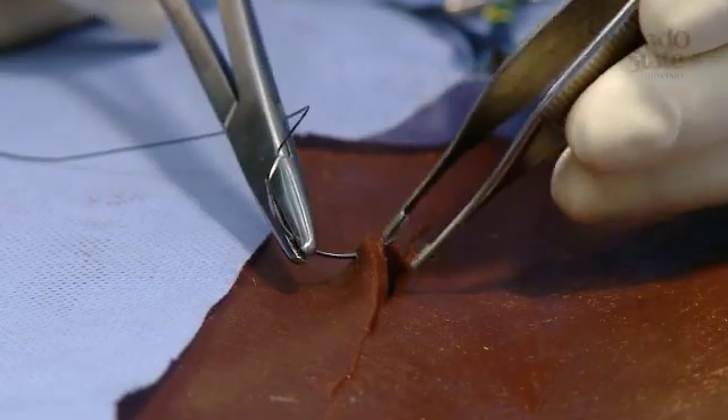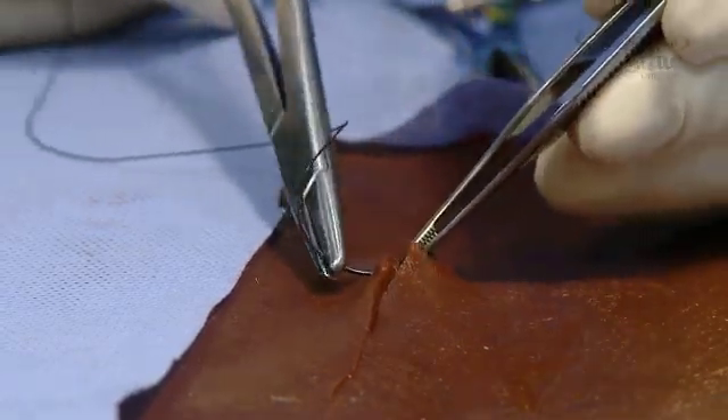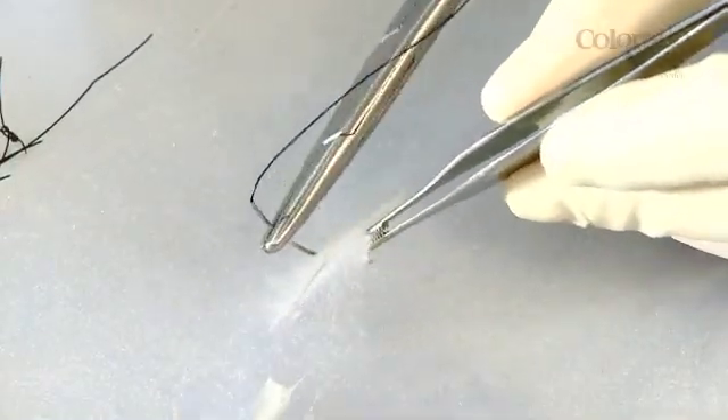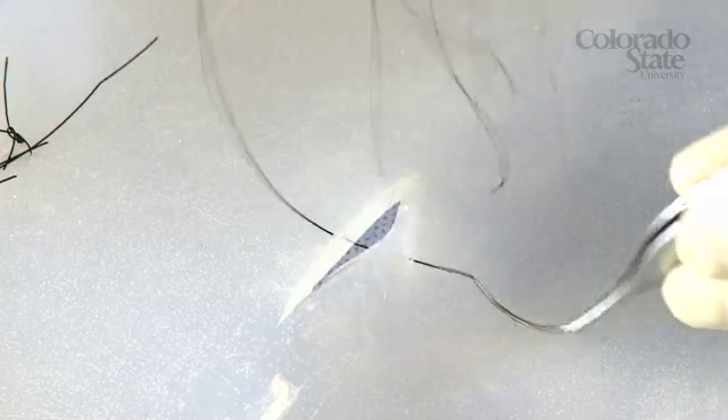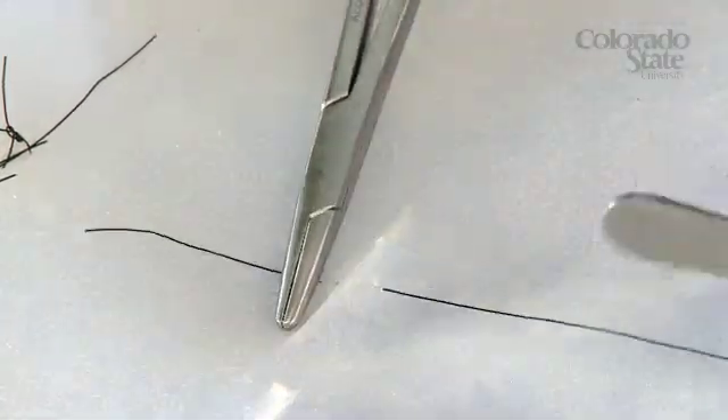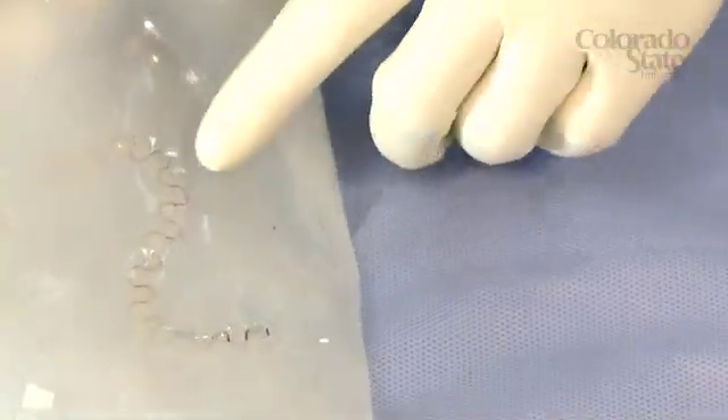Suturing is also something that's important, and it's something that can be done in this model very well. The other thing that we're doing is to create a skin and subcutaneous layer that is translucent, so the students can create the incision and suture it, and actually have a three-dimensional view of their suture placement.